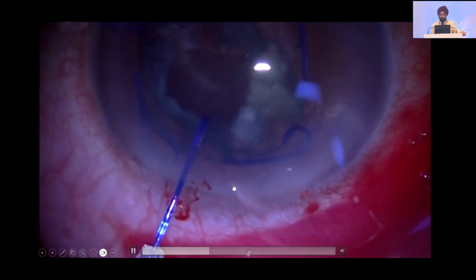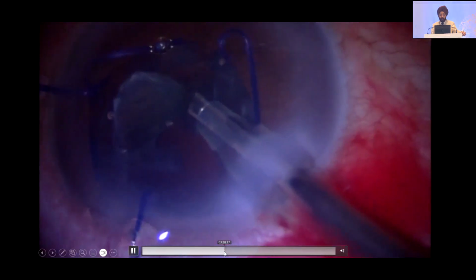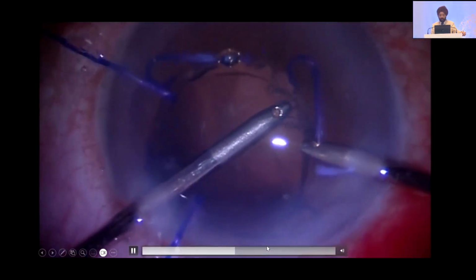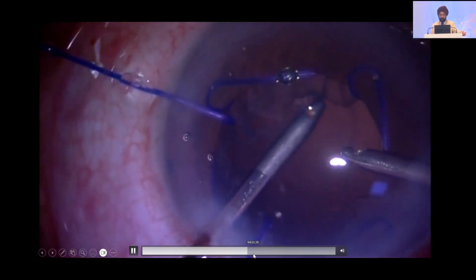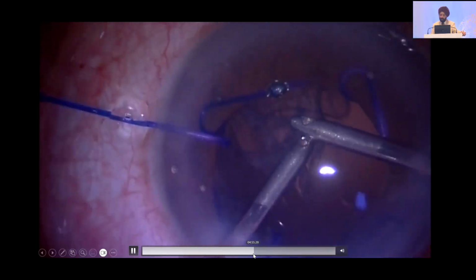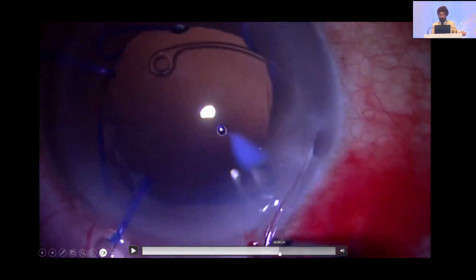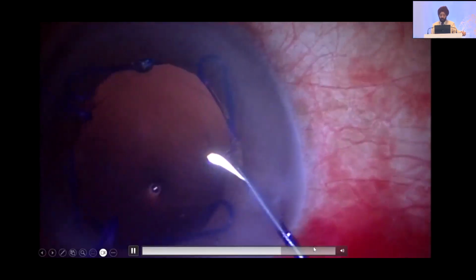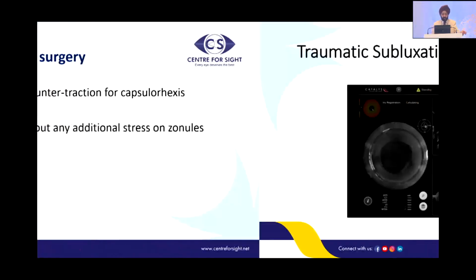And there is a second capsular hook that has been an iris hook used as a capsular hook which is there. Once you have done that, you can see that the procedure of surgery becomes relatively easier. You have a stable bag, you have a good capsular access. You have to do a slow motion phacoemulsification. Bimanual IA is therefore recommended. Now putting in a capsular tension ring to get the entire thing in position so that it remains in position. And once you have done that, you put in an intraocular lens. So this is something where a femto laser is obviously going to be helpful.